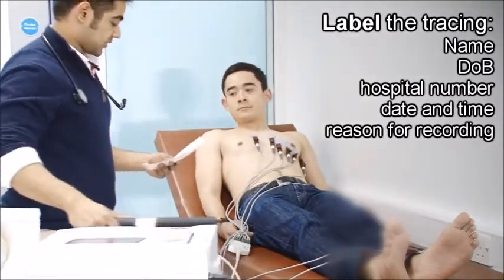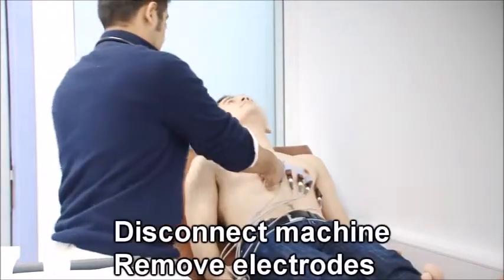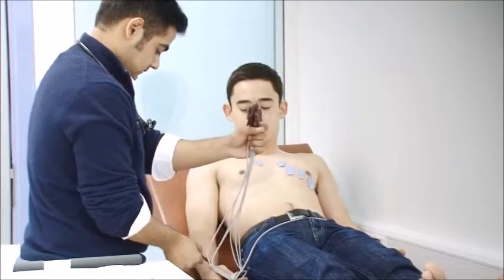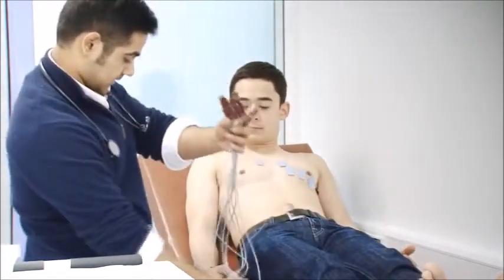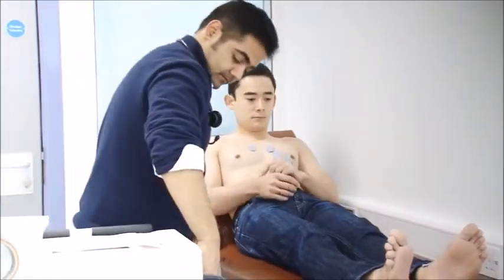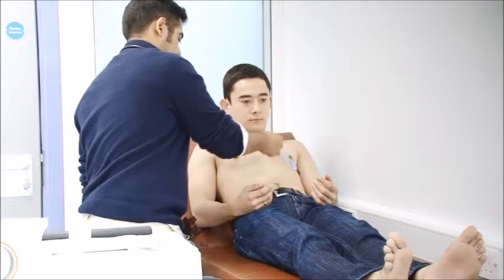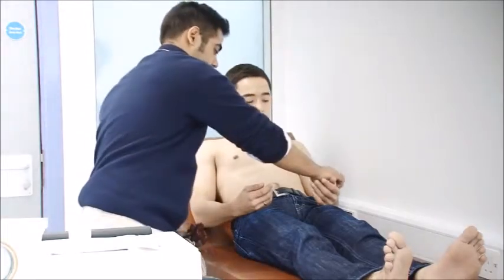Okay, so we've got your readings here. So what I'll do, I'll pass this on to the doctor and he'll be able to go through this with you. And so right now I'm just going to quickly take off the leads. So I'm not going to keep you in this position any longer. Hope that wasn't too uncomfortable for you. Okay, so this might be quite painful. Please let me know if you do feel any pain at all. I'm just going to take off these pads and dispose them. All right, thank you very much.